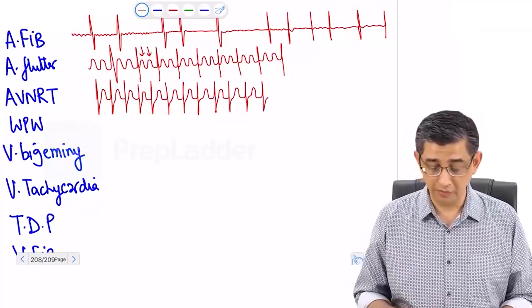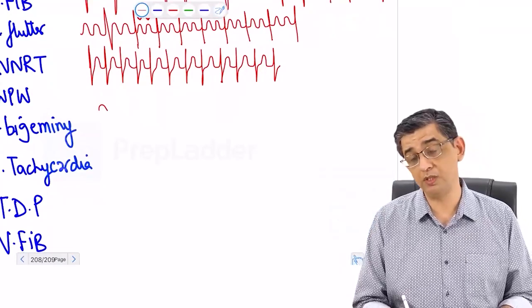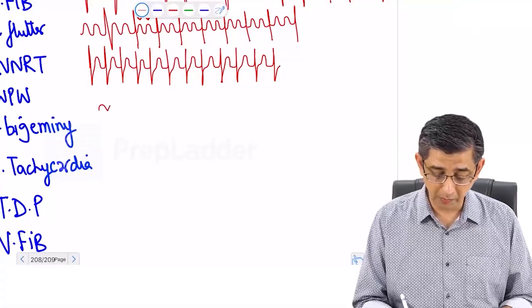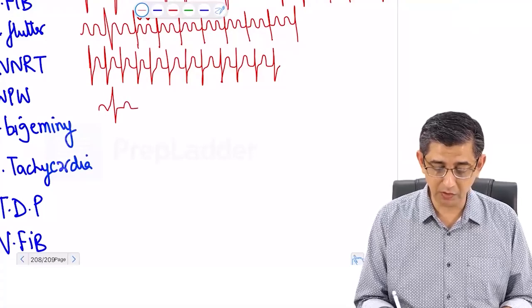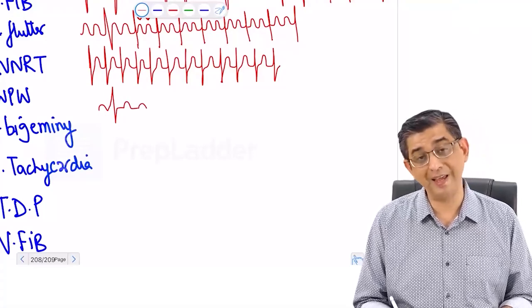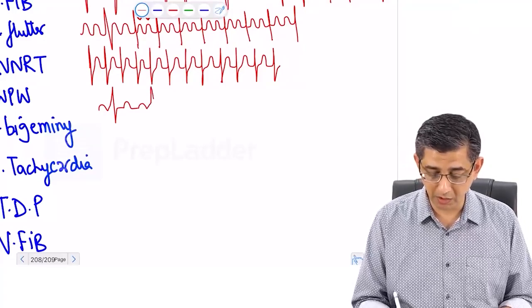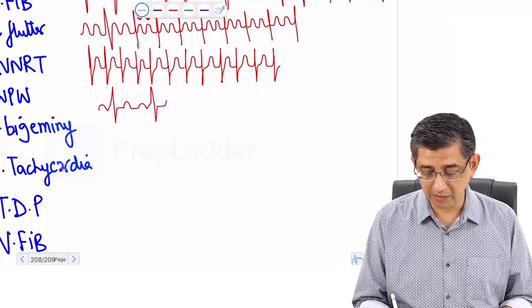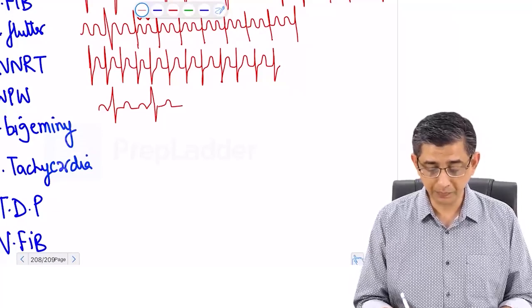When it comes to WPW in a patient, the moment the P wave will finish, you will notice there would be no Q wave. Then there will be a presence of a delta wave that will be easy to decipher because of the change of the slope. The highlight is exactly when the P will finish, you will notice this upswing, change in the upswing rather, and a delta wave present. And along with that, obviously, family history, if given, is all the more welcome.